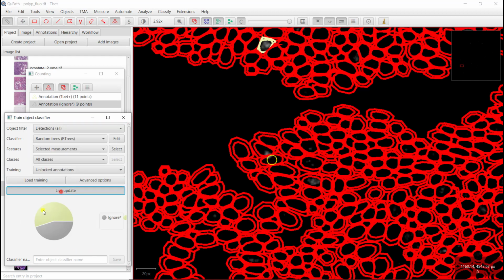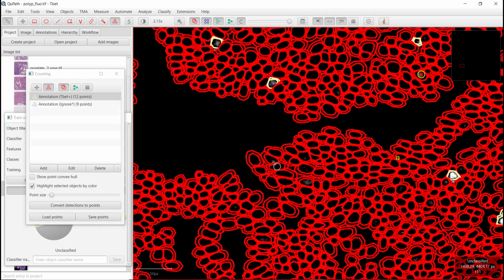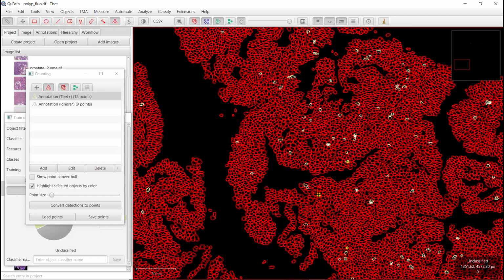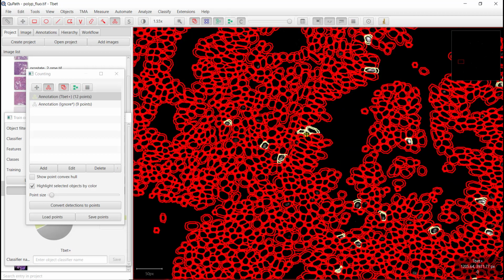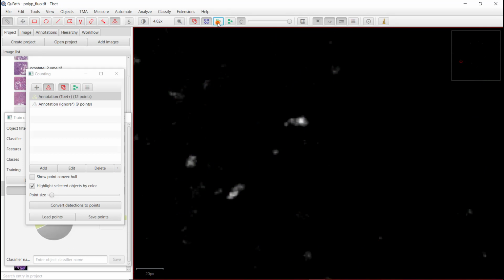And I guess I remove the live update, and now, you know, it removed everything. But maybe it's a better decision. It's also up to you, because now I put it back, and I think it's fine. You really need to know your markers to know what is real or not. And this is not my study. I work with people in this study, but this is not my study, so I'm not sure about.